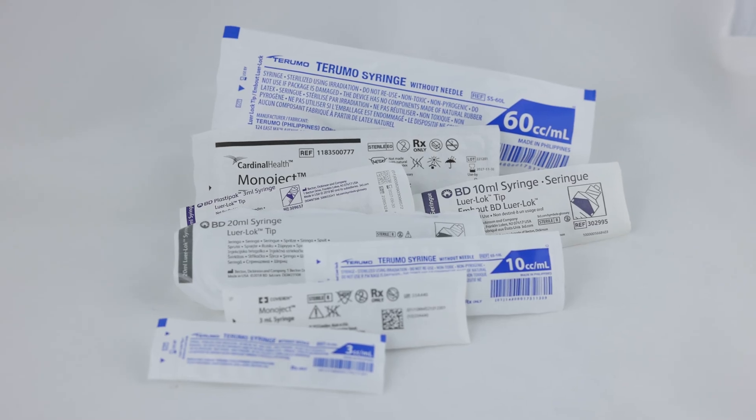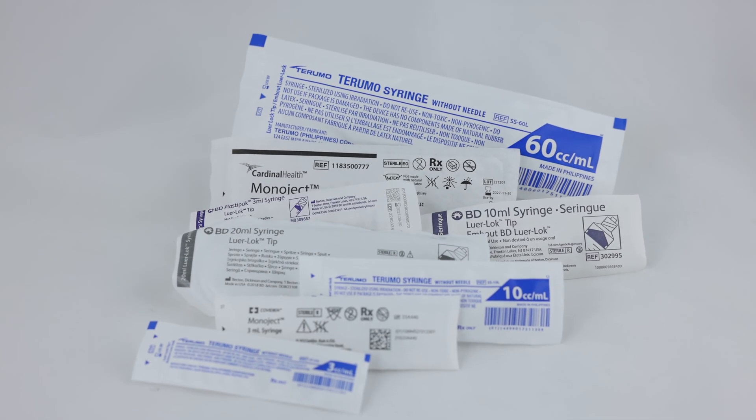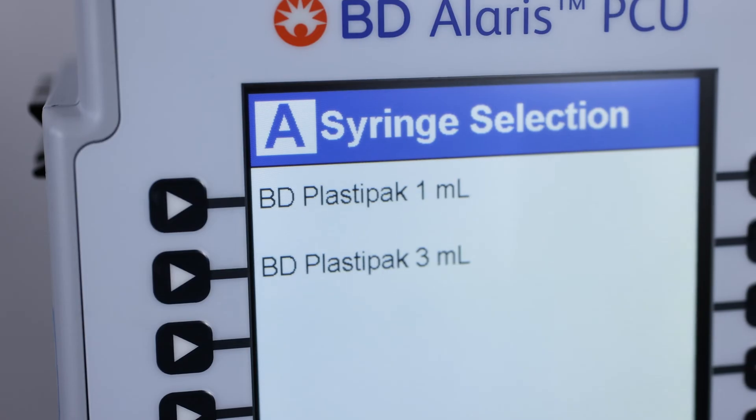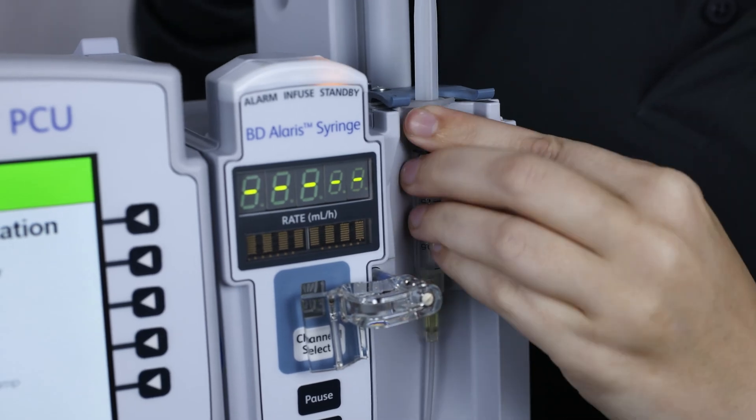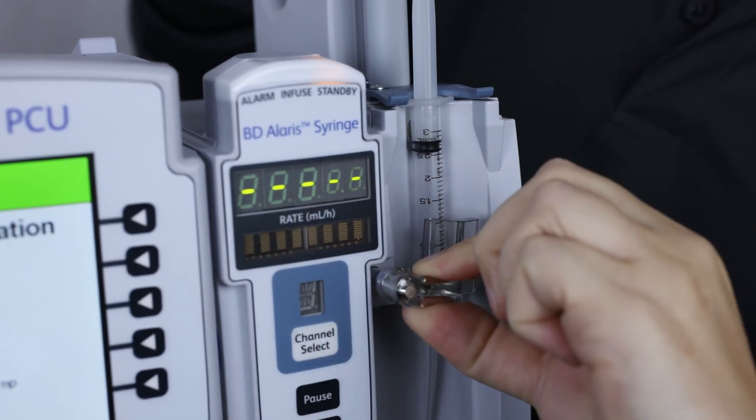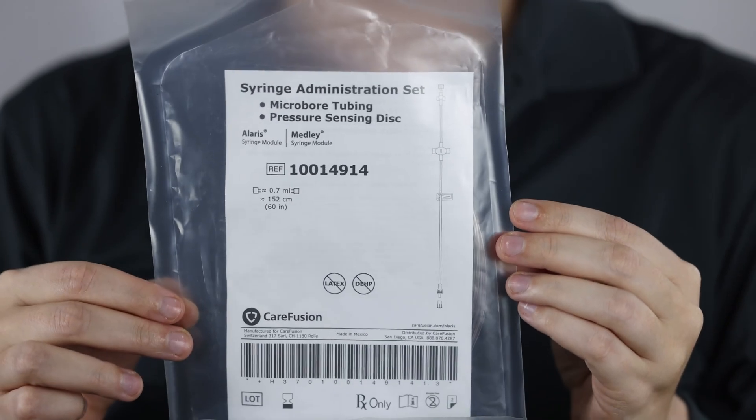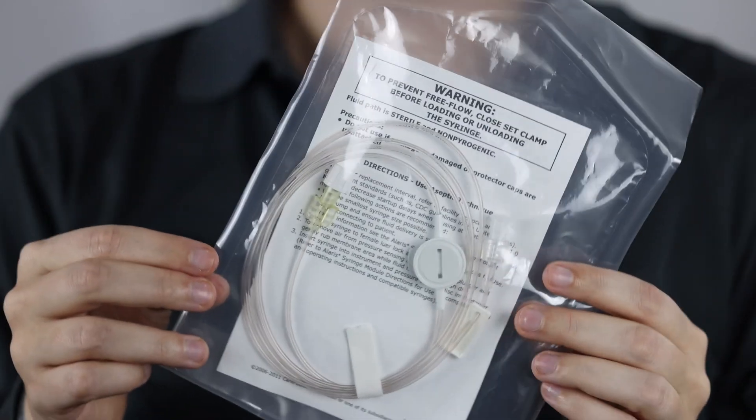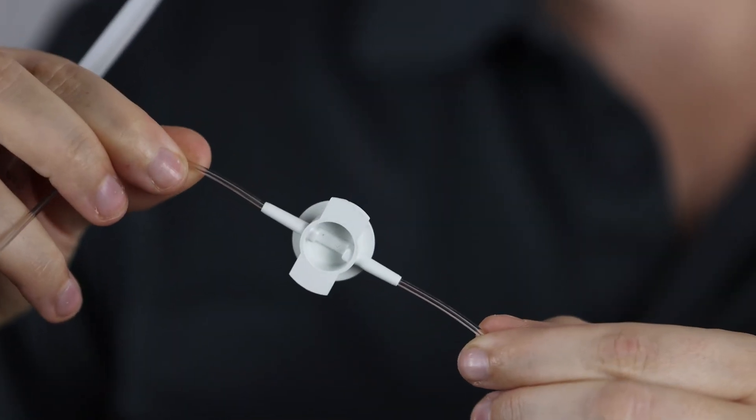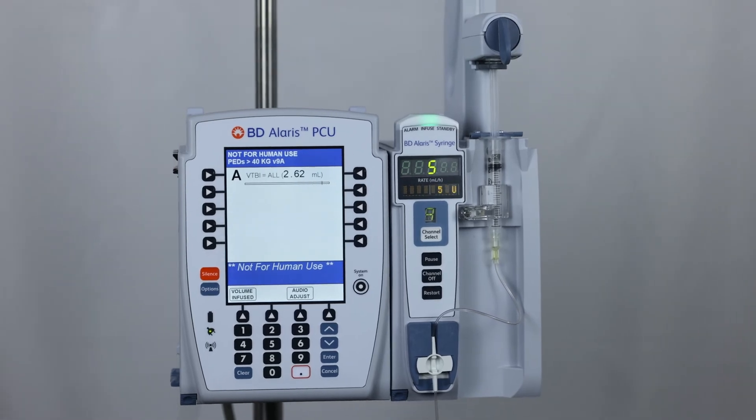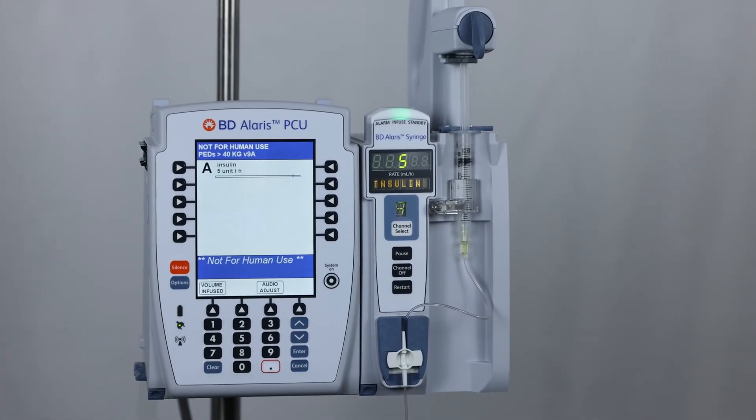Acceptable syringes to use with the 8110 syringe module include those manufactured by BD, Monoject, and Terumo, ranging in size from 1 milliliter to 60 milliliters. The pump module has an auto-detect barrel clamp that senses the size of the compatible syringes. Specific tubing sets manufactured by BD are available that include a special sensor disc that closely monitors the pressure inside the line when connected to a patient. The flow rate range for the Alaris 8110 is from 0.01 to 999 milliliters per hour.